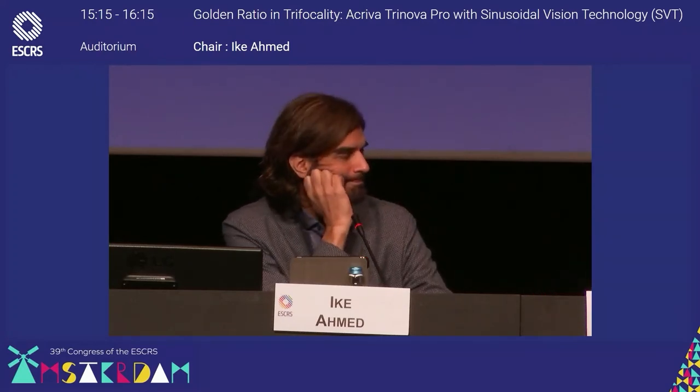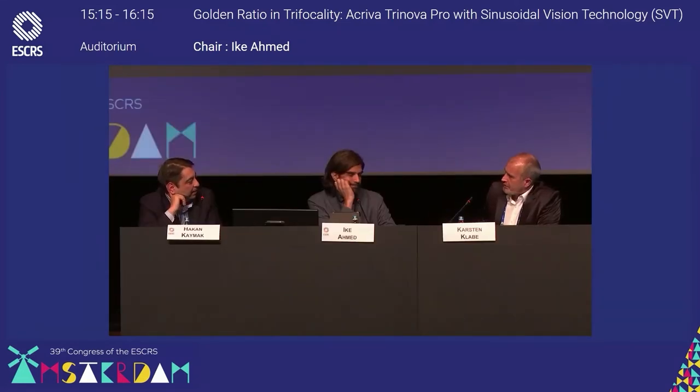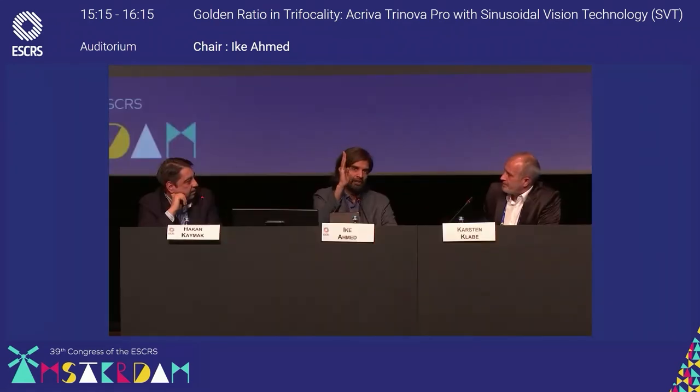But I try at least doing that. Would you add miotics at the end of surgery routinely with these kinds of lenses? I don't add miotics, no. Only reflex and coaxial illumination. Correct. So I line it up with the first Purkinje image off the cornea, lined up with the coaxial light in the microscope, with the patient fixated, and I'm looking at the camera right there. That's exactly what I look at.